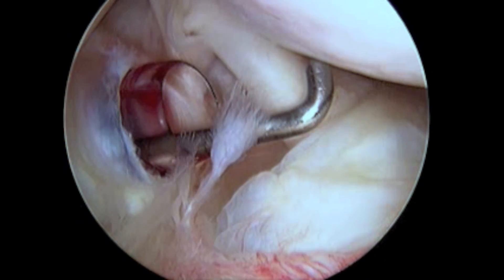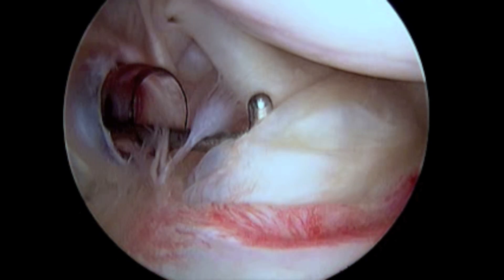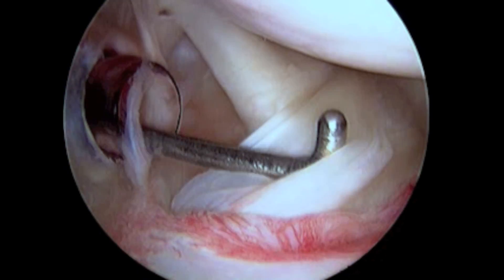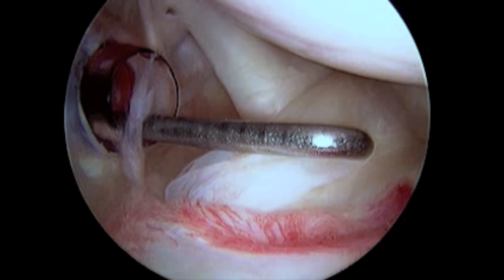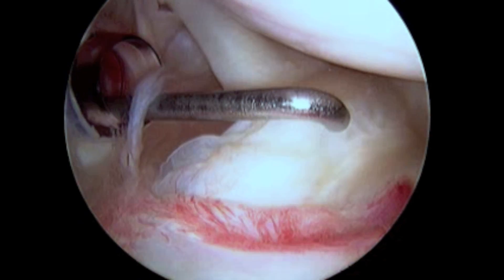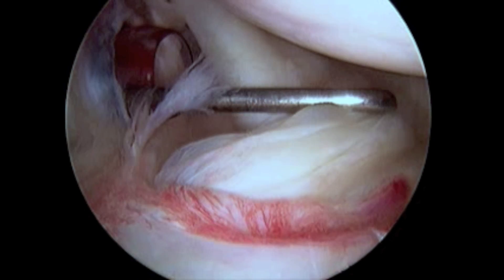Just overlying the subscapularis is the middle glenohumeral ligament. This ligament arises from the anatomic neck of the humerus and inserts into the mid-anterior portion of the labrum.